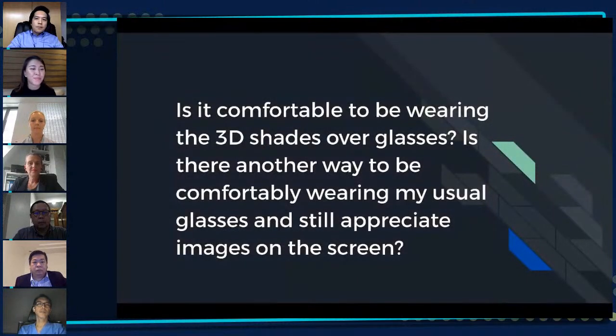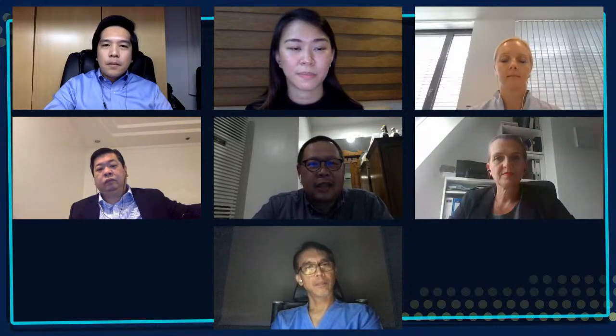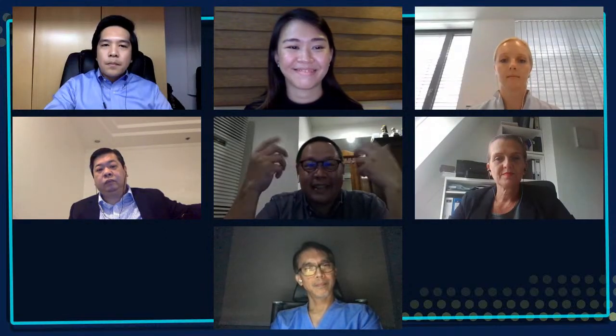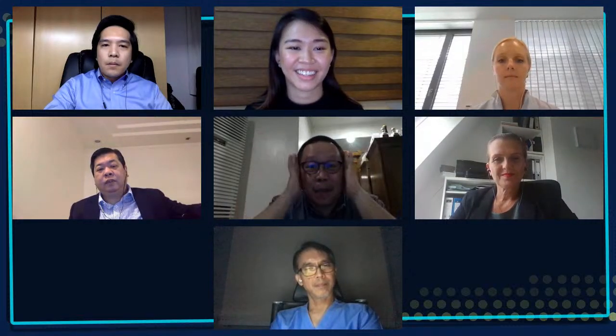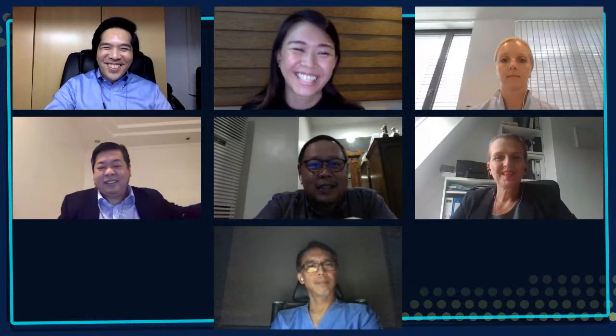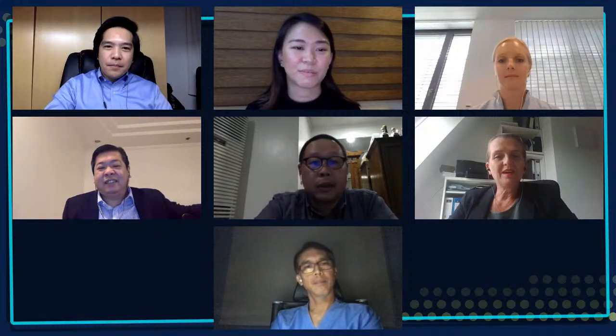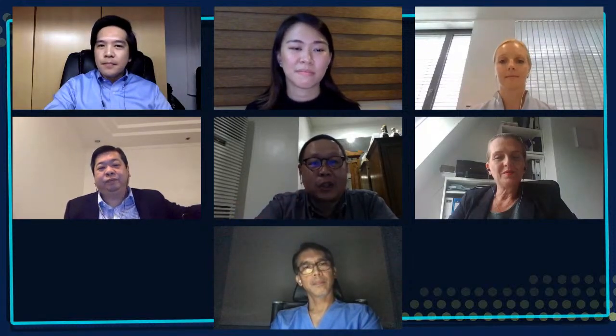All right, thank you very much. We have another question. Is it comfortable to be wearing the 3D shades over glasses? Is there another way to be comfortably wearing my usual glasses and still appreciate images on the screen? I believe Dr. Cheng mentioned this a while ago. Yes, I think it's not difficult. I just wear the 3D glasses over these glasses, then I take them on the side and I tape them here and I look like an idiot, but it works. It's still clear. But I tried it with my glasses off. It's really difficult. I need my glasses on.